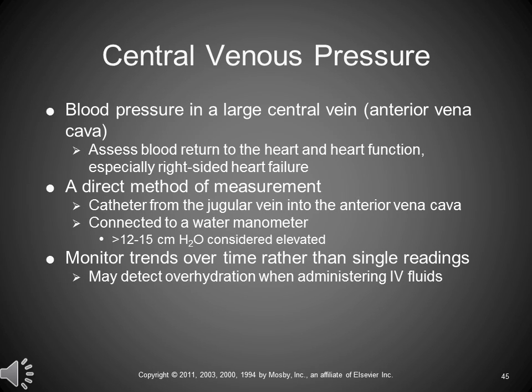That means you're giving too much fluid and that you are starting to overload the right atrium, which is going to cause fluid to back up in the lungs, and they're going to drown. Back off. You're going to have to read trends rather than absolute numbers on a one-time basis. You're going to have to turn the little stopcock, read the pressure, turn it off, come back 5 minutes later and check it. Once you've got a good reading and a good baseline, then you can check it, depending on circumstances, every 5, 10, 15 minutes. But you are going to need to check it periodically.